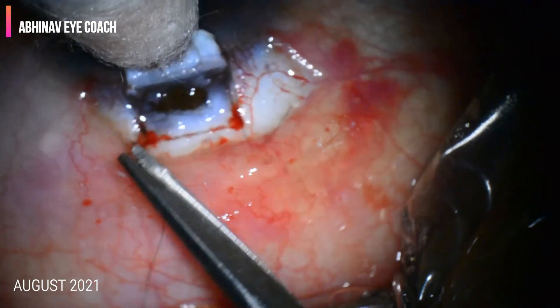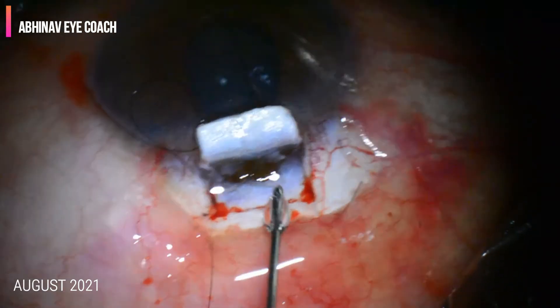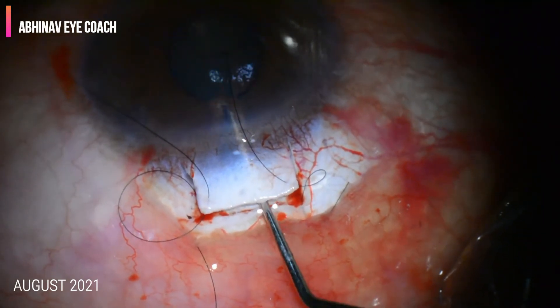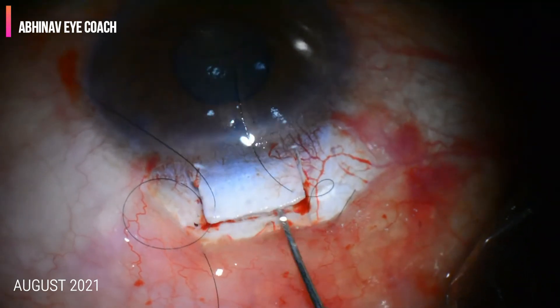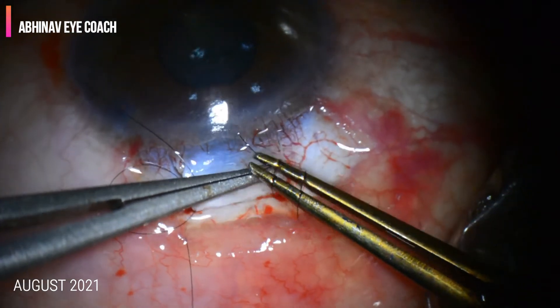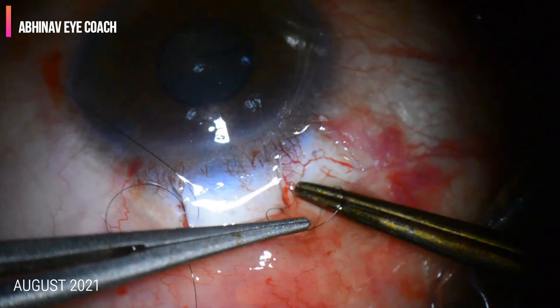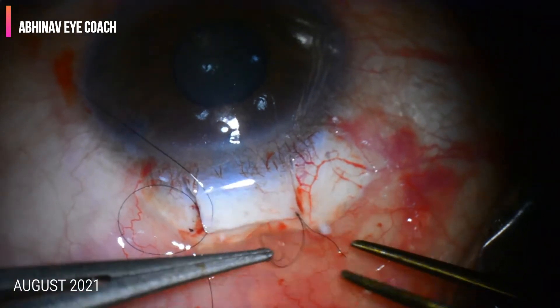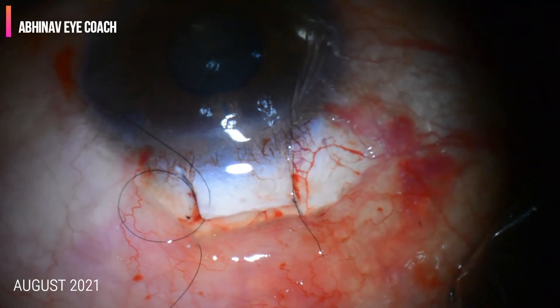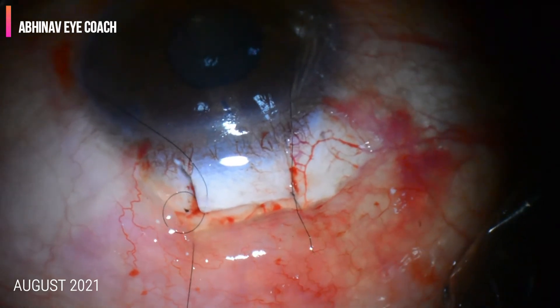Now it's time to close the anterior chamber by tightening the pre-placed scleral flap sutures. The pre-placed sutures are tightened. Care must be taken that both scleral sutures are tightened equally on both sides. If one-sided suture is tight and the other is loose, there are chances of excess leakage from the scleral flap.